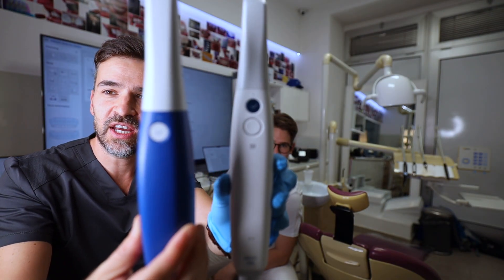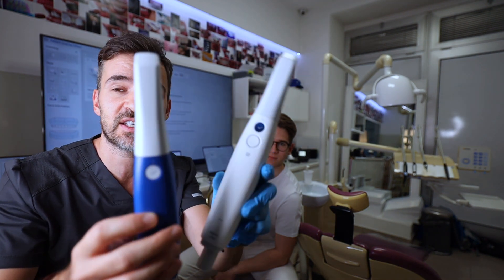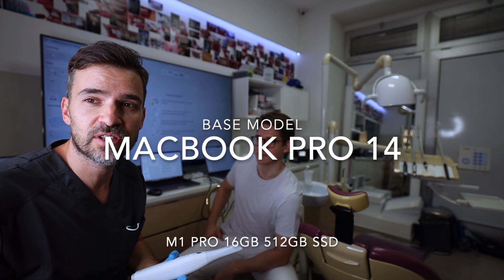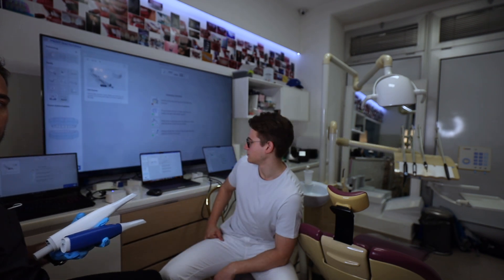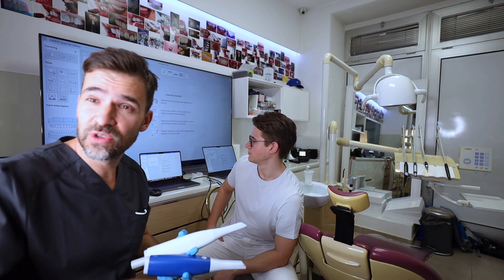This is maybe the best buy scanner you can get today. We'd like to thank Timco for lending us these scanners for today's test. We're testing on a MacBook 14-inch M1 Pro, a MacBook 16-inch M1 Pro, and a gaming laptop — the Gigabyte with an i7 processor, 32 GB of RAM, and an RTX 3070 GPU. We'll put the specifications on screen, and we'll start scanning with the gaming laptop first.